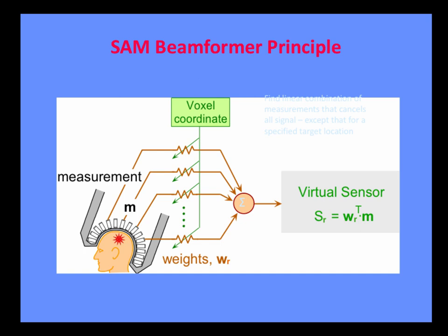What we do with the beamformer is a little more interesting, because most of us really care about cognitive processing in the brain, which is a lot more elaborate relative to focal dipoles. Basically, we're going to create a set of weights that enable us to beamform to a very specific location in the brain. That's what is meant by the linear constraint minimum variance beamformer. We take a linear combination of all of the data from out here with an appropriate set of weights that steers the beam to a specific spot in the brain. It's a little bit different from the dipole.